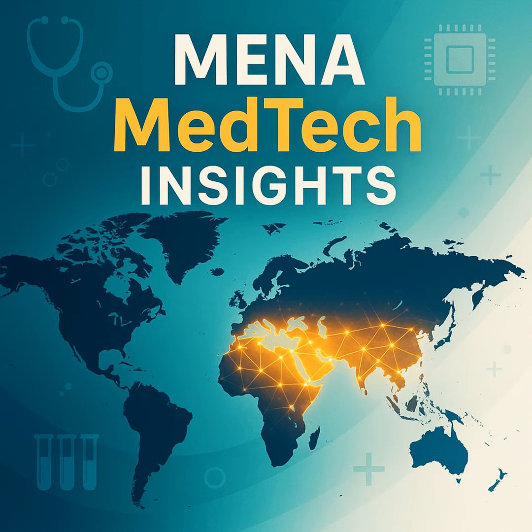The stakes get higher with Class C. This includes software that provides critical diagnostic information that directly impacts treatment. For instance, an AI-powered tool that analyzes CT scans to detect early signs of cancerous nodules would be a Class C device. A mistake here could lead to a delayed or incorrect diagnosis with serious consequences.